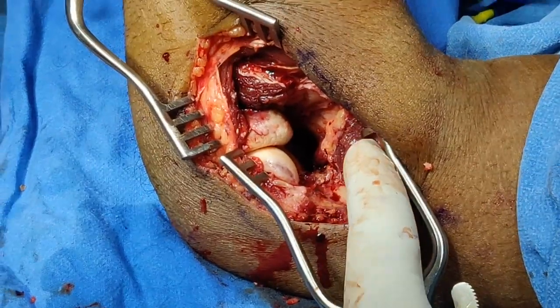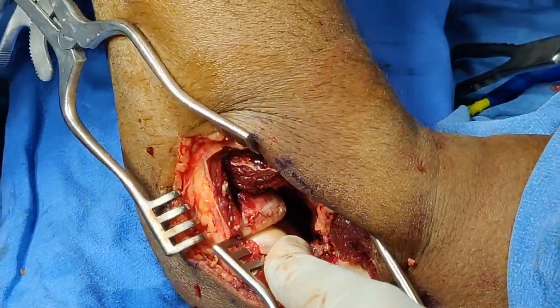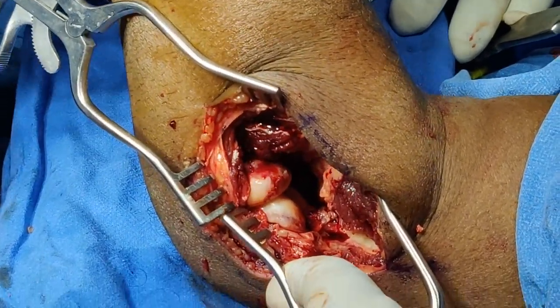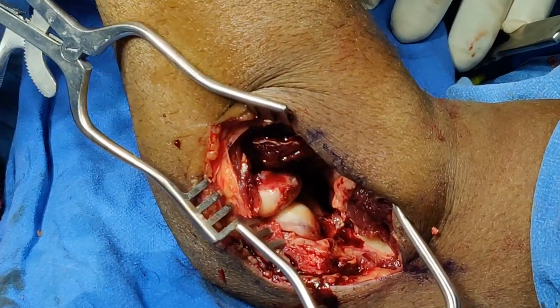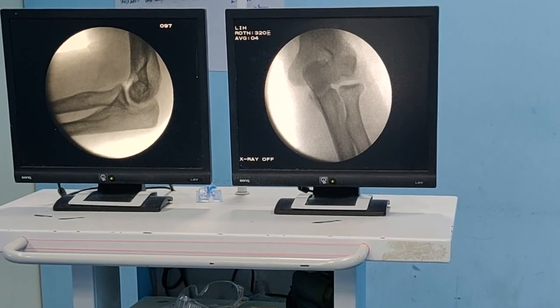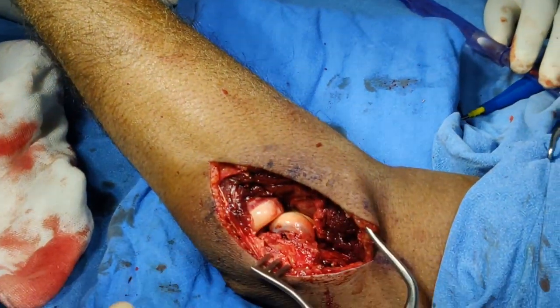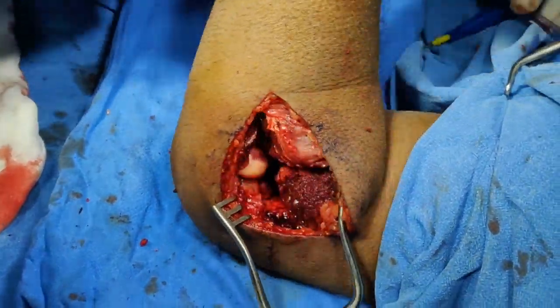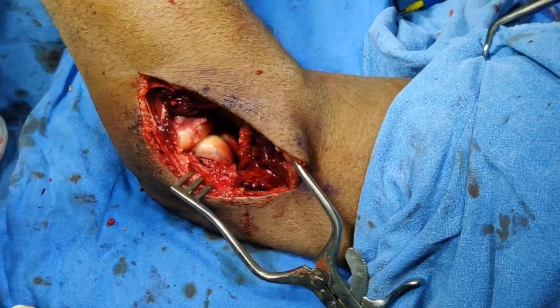By applying some traction and directly manipulating the fracture we have managed to reduce it. You can see the radial head is nicely articulating and the capitellum looks well reduced. Before proceeding to fixation, take appropriate X-rays to ensure anatomical reduction. We have checked the position on the C-arm — both AP and lateral — and it looks pretty good. Even with the lateral soft tissue open this is very stable: full pronation, full supination, full flexion, full extension, and the fracture is now stable due to the compressive force of the radial head.